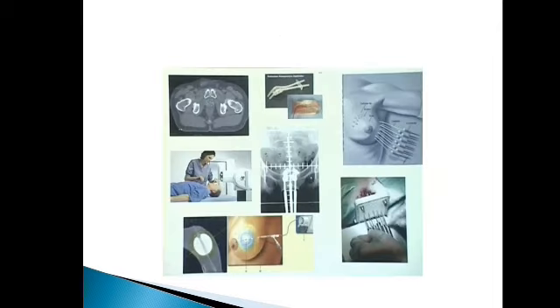And what is brachytherapy? You see that brachytherapy can be used in different types of cancer, for example, prostate, breast, head and neck, and in all of them, you can use a radioactive substance that is inserted in the tumor or bed of tumor.